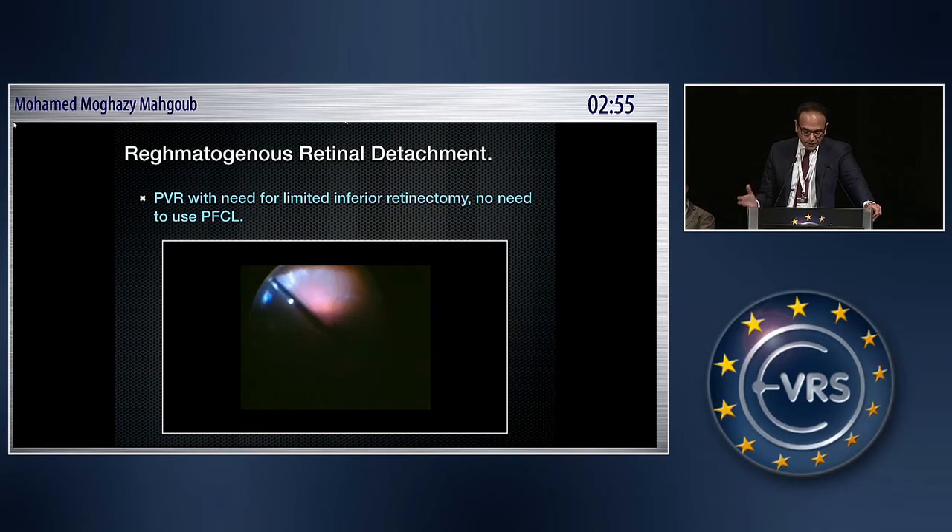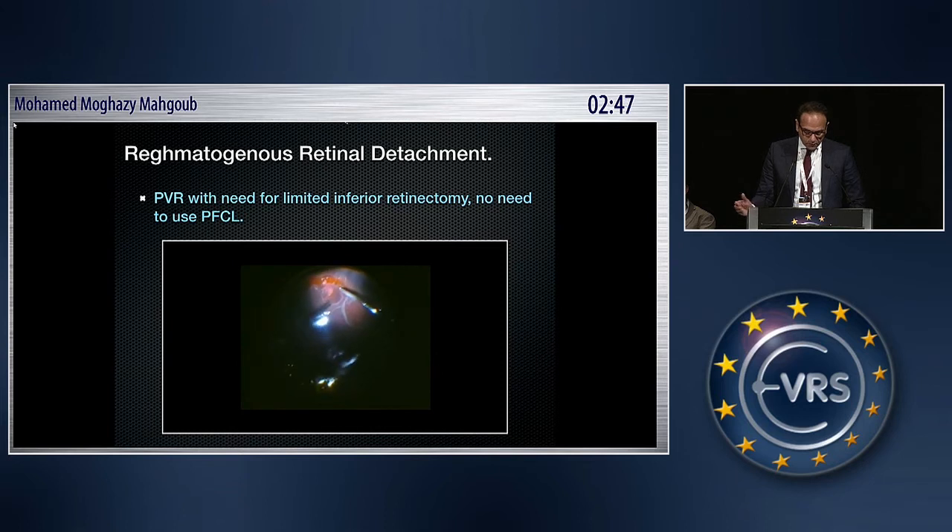In cases of PVR with need for a limited inferior retinectomy, there is no need to use PFCL. Under air, you can extend your retinectomy as far as you need to go. This is a long-standing case with a retinal cyst, as you can see here, but safely under air you can continue the retinectomy.